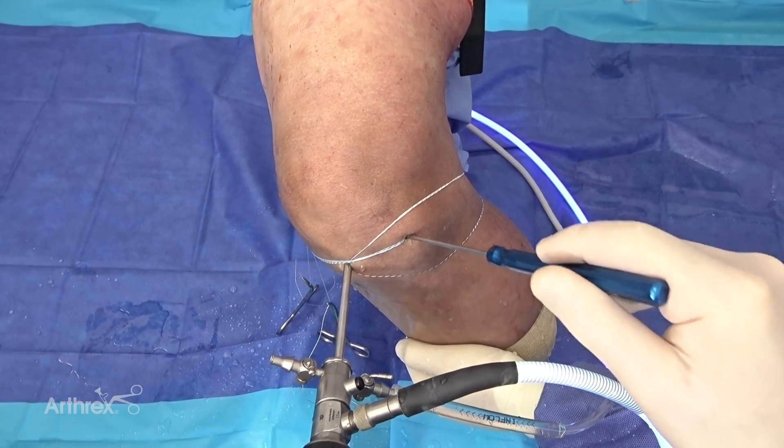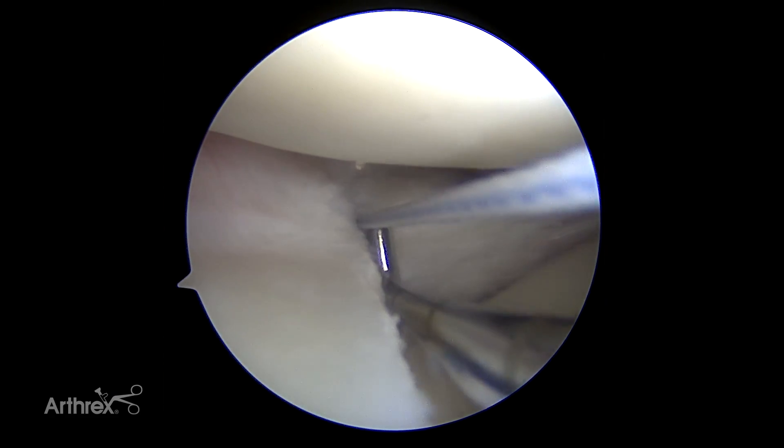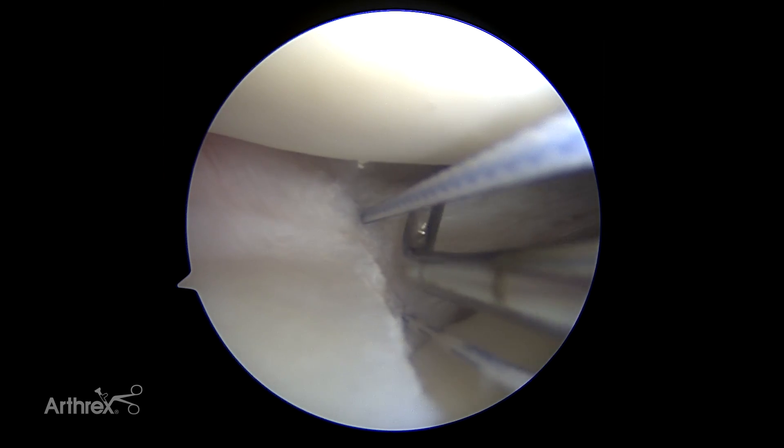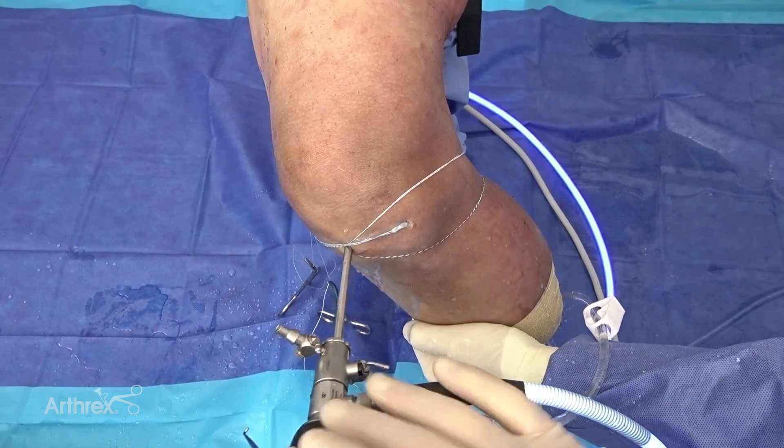The last thing I'm going to do is check the depth from the capsule rim to the free edge. This probe — those marks are five millimeters — so it looks like it's about 10 millimeters for the depth of our segmental graft.